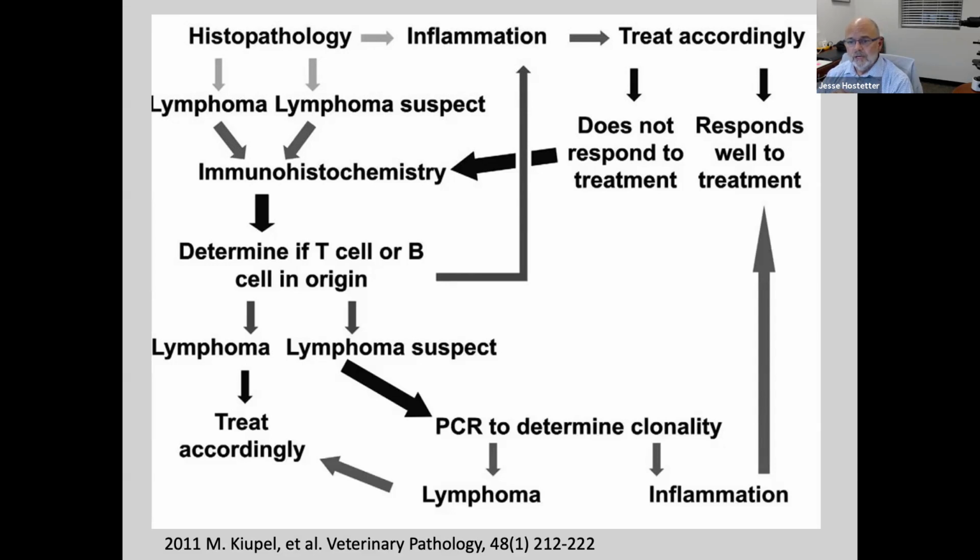Is lymphoid effacement enough evidence to call lymphoma in cats? I've seen cases or two of lymphoid tissue with effacement into the lamina propria. If I understand your question right, you're not talking about gut-associated lymphoid tissue. You're talking about lamina propria, where you've lost the structure because there are so many lymphocytes there, and for what we call large cell lymphoma, or depending on how you want to call it, the EATL type 1, lymphoblastic lymphoma, I think the answer is yes.